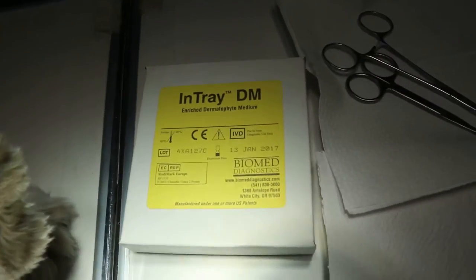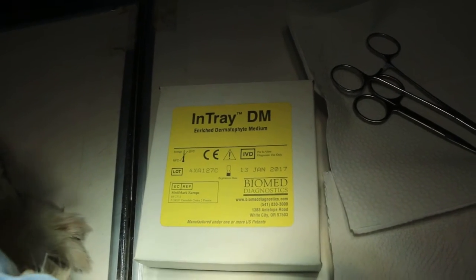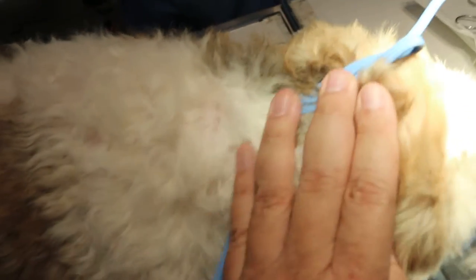My assistant will now describe how to use the test called In-Tray — the In-Tray Enriched Dermatophyte Medium — to culture the ringworm. She will continue with the process of how to do it.